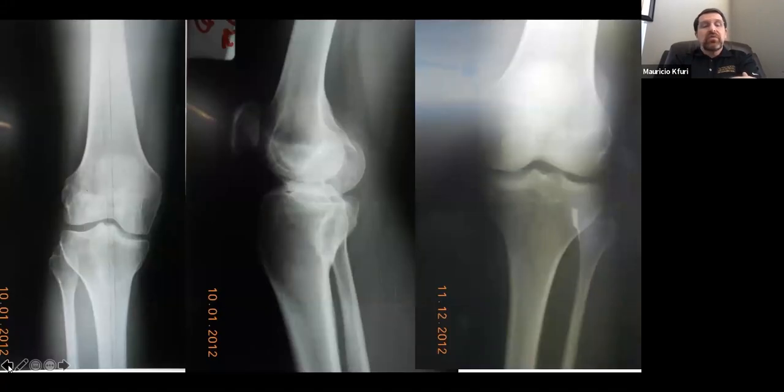So this is angular, and you see that the medial tibial plateau looks shorter or not as wide as the lateral tibial plateau. This gives us a sense that this is a unicompartmental deformity, and the lateral view confirms that what happened here is that the medial tibial plateau was displaced, generating an angulation of the joint, which is predominantly in the medial compartment.